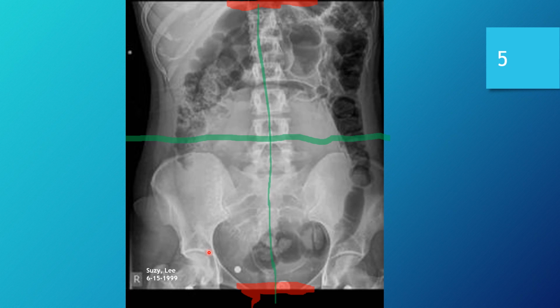Moving on to number 4, does the image demonstrate adequate exposure properties? The contrast for this image looks fine. Differentiation between bowel gas, bowel stool, and bony structures is all readily discernible. Contrast for this image is good. I don't think the technique was bad or a poor choice. I think that was done very well.